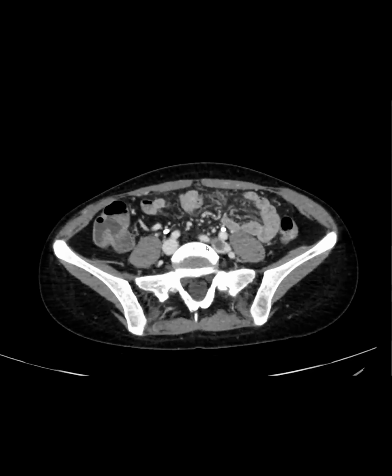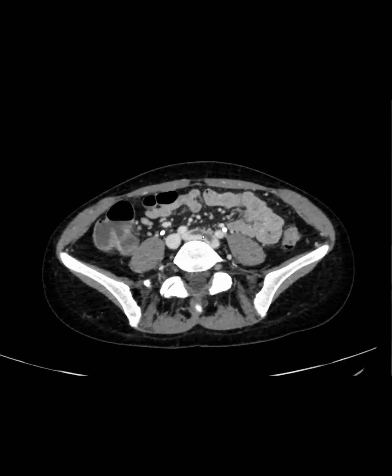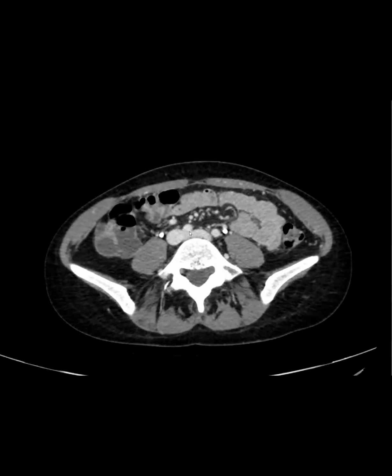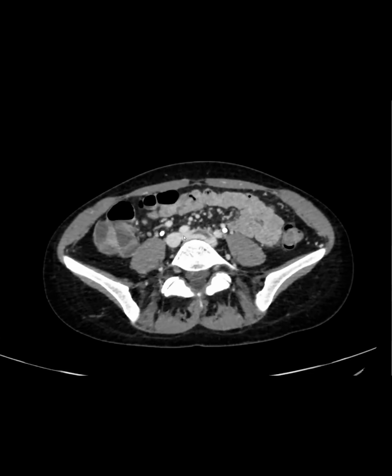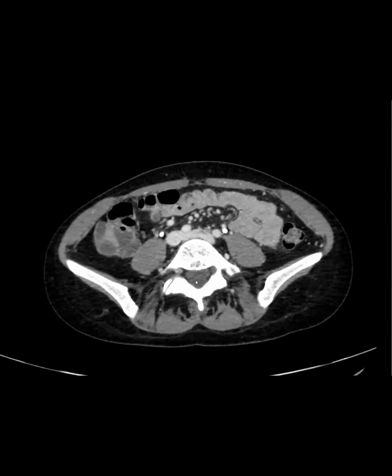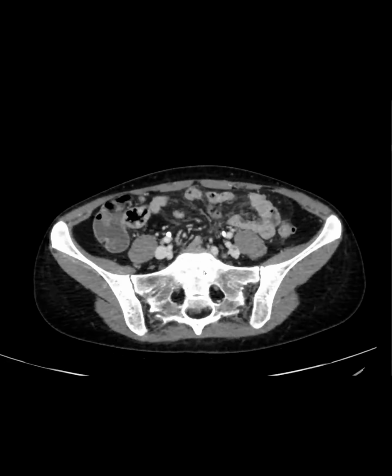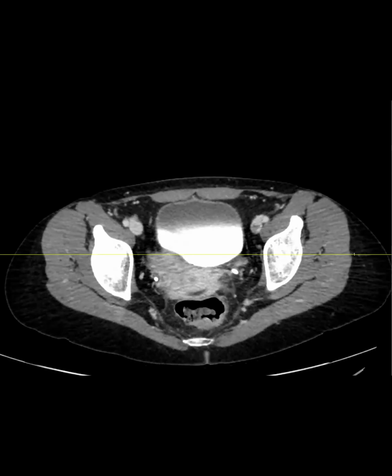So our vascular surgeons went in, they did a thrombectomy, they did fluoroscopy, and they also did intravascular ultrasound where they saw that there was actual compression here. So then they felt confident that it was actually May-Thurner's, and they placed a long stent from the IVC into the iliac vein, and did a complete thrombectomy. So anyway, nice case of May-Thurner's.